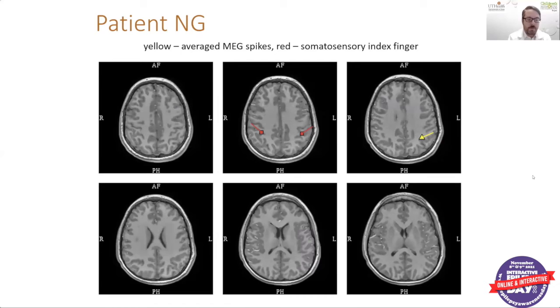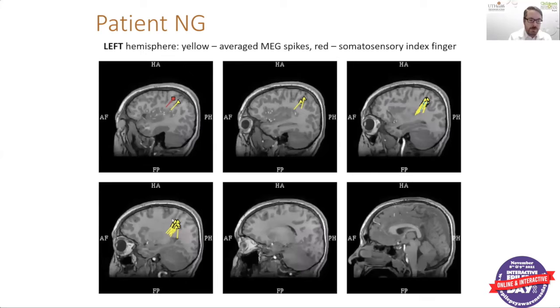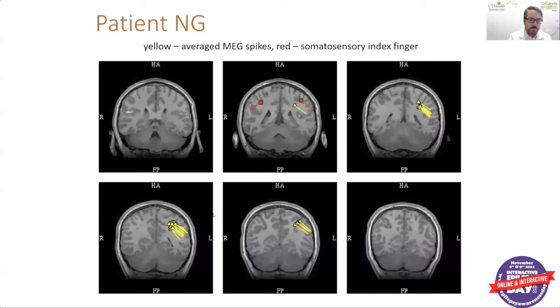Here you can see what we always hope for on the MEG — a cluster of spikes all in relatively the same location, all with that dipole orientation pointing in the same or a similar direction. The blue represents the average and the yellow triangles represent the individual spikes. In different planes and orientations, you can see a really nice cluster with all electrical activity traveling in relatively the same direction.